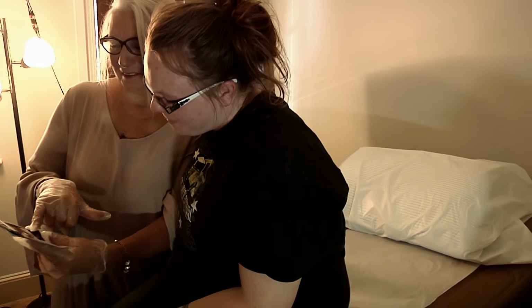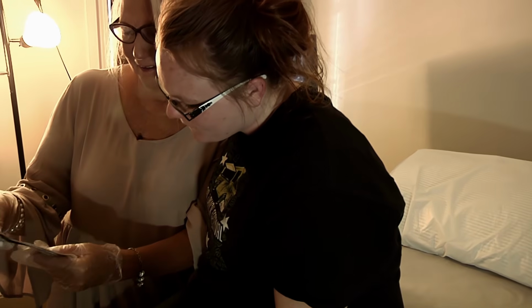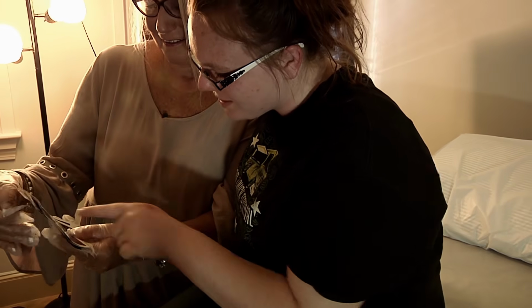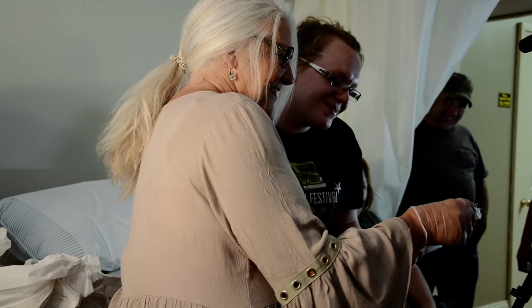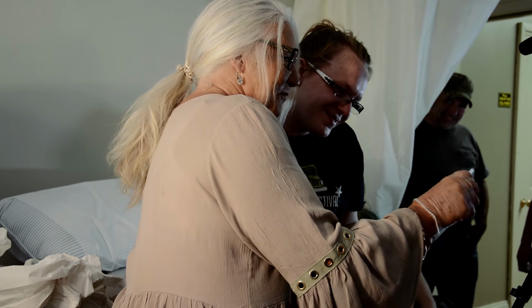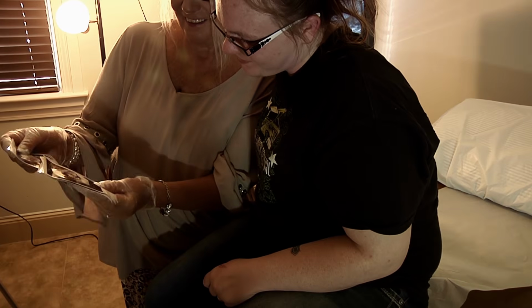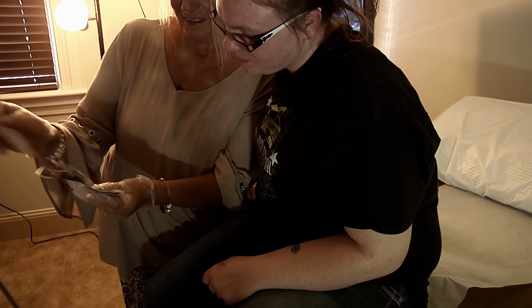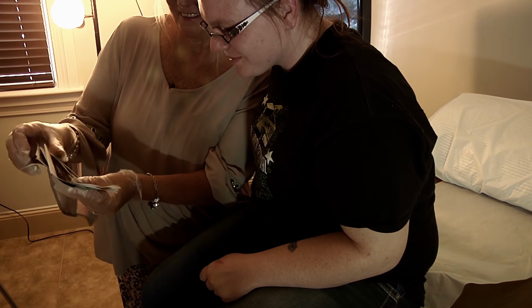Oh, here's some pictures. This is the one of the face, the mouth open. And it's another one of the face. Oops. That's a good side profile. Oh, there's that yawn when he started to open his mouth. We got a few of those. Let's see. There he is again. That's a good side profile. And this one looks like he's laughing. See, he's kind of smiling there.